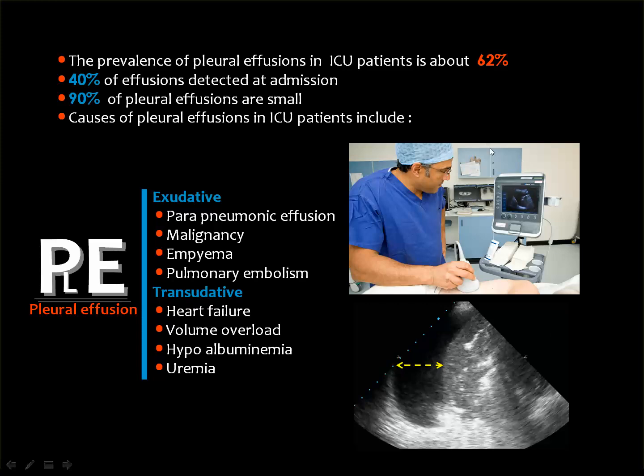As you see in this picture, ultrasound is considered one of the best imaging modalities that can be used in ICU. Ultrasound is an easy, rapid technique, and is real time, and can go to the patient in bed, and can use the Doppler facility to image the vessels as well.